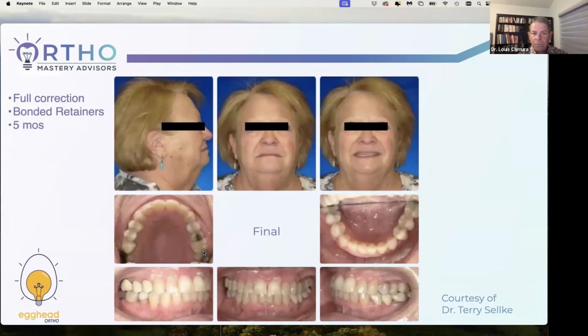Can you do it in 5 months on your own? Maybe not. It's hard to know, right? You can, but if you're working with somebody, being collegial with somebody, they can do the setup and help you with it. They can help you go through this. When do you see her? And quite often in a 5-month treatment, I wouldn't see them at all. I'd see them at the beginning and I'd see them at the end, because in between we're doing virtual monitoring, digital monitoring, or the monitoring through another company. You can see this stuff from home, from the beach, from Florida, from wherever.